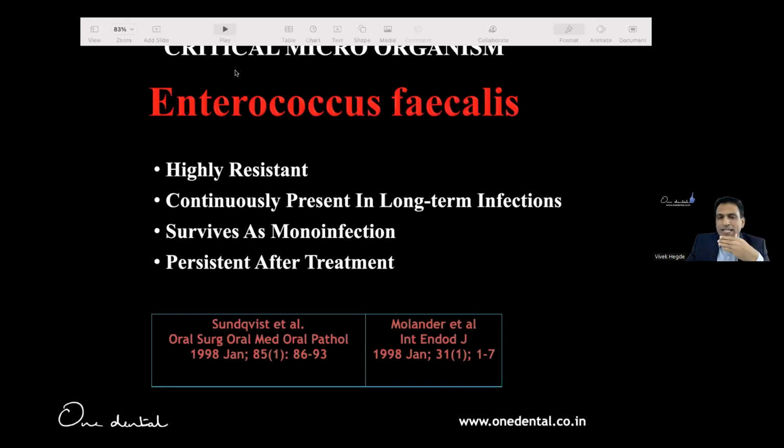And there are a few more studies here. So all these people have said this, and if you saw the Journal of Endodontics, maybe 2012 to about 2017, those 5 years had plenty of articles on E. faecalis, only E. faecalis. Today we know it is E. faecalis, and a lot of chemicals don't work on E. faecalis. Not even hypo as much, not even your calcium hydroxide, and nothing else. So that's when possibly laser became popular. I'll share my views on both of them.